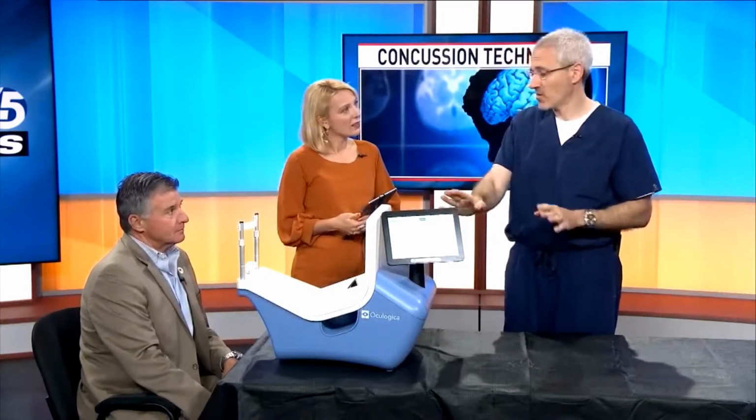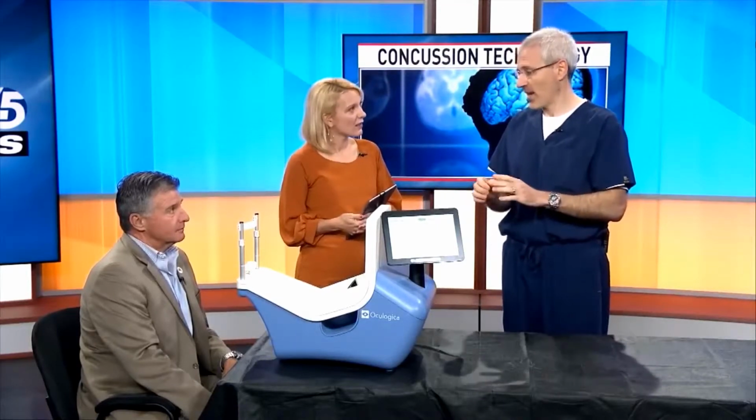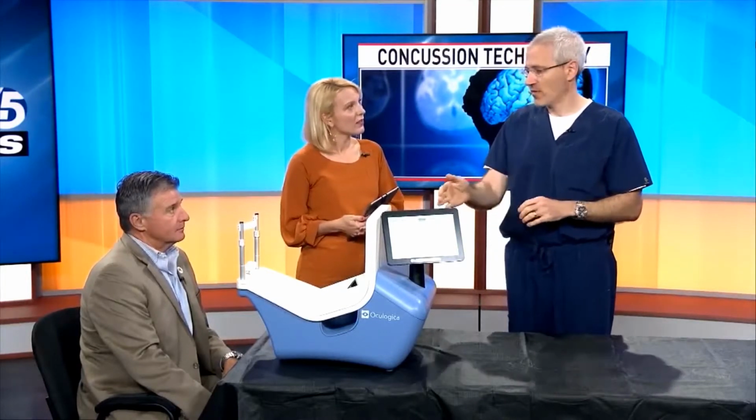The beauty of this thing, though, is if it reads negative, the negative predictive value, meaning if it's negative, it's really negative, is like 97%. So if your kid gets hit in the head or something and you bring them in and it's negative, they can certainly go back to playing sports immediately.